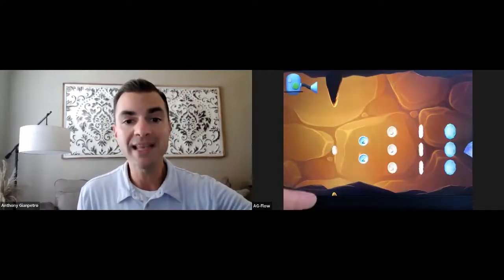Some people get confused when they look at what's that 0.4 to 1 for the top? Why is it 0.4 to 1? And then what's that 6 and 2? Those are the presets that we give you, the options, I mean, for making it difficult. Well, a little guide that I want you to reference is this, okay? So if you think about the stalactite on top, 0 to 1 makes the exercise harder, and it's technically 0.4 to 1.